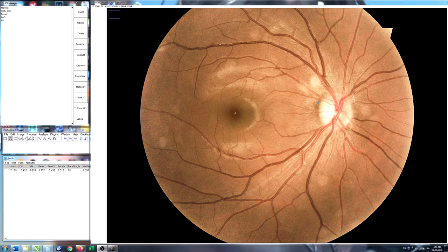The optic disc is, of course, the blind spot — all those activities where we were looking at the blind spot and trying to get images to fall on it so they disappear, this is that structure.